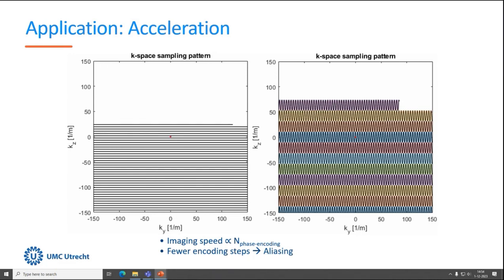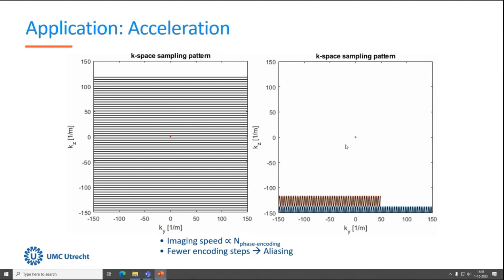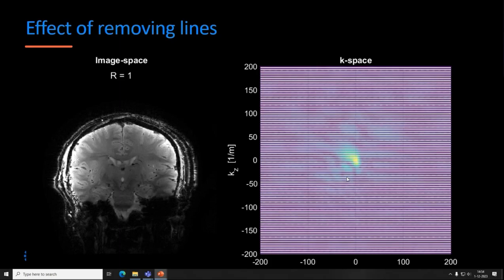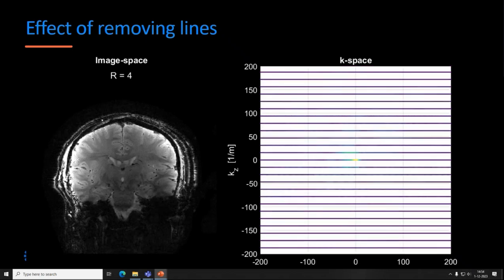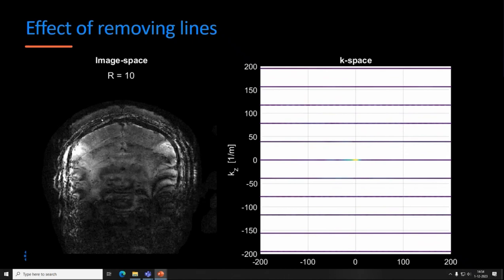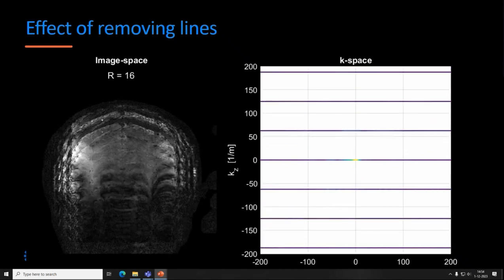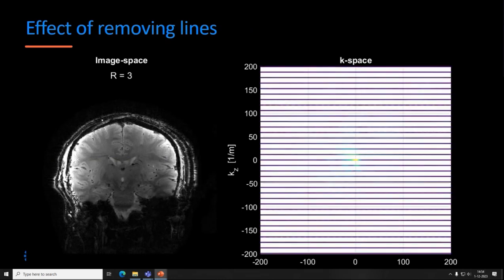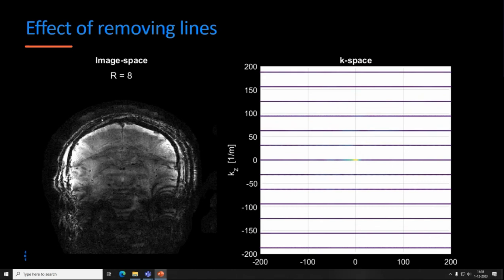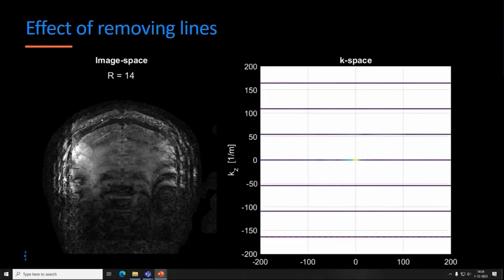So what you can do is skip K lines, and you can also do that for the readout lanes. You can just separate them, and you can speed up things. So what's the effect? Normally, if you skip lines, you'll see aliasing, right? You see it folding. You have to unfold the artifacts, the signal you don't want, and you have less signal left, fewer K lines, so your SNR is dropping drastically. But this is normal accelerating scans using SENSE.